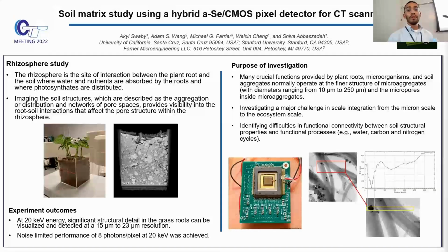We were able to acquire images using the ARTIS Zeego CT system and compare these with the images acquired with a hybrid amorphous selenium CMOS pixel detector.